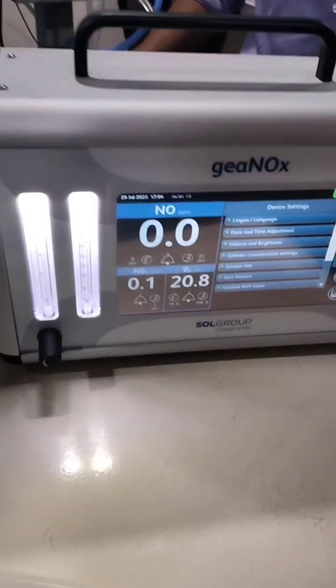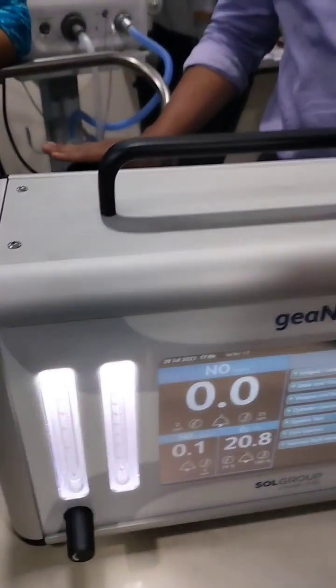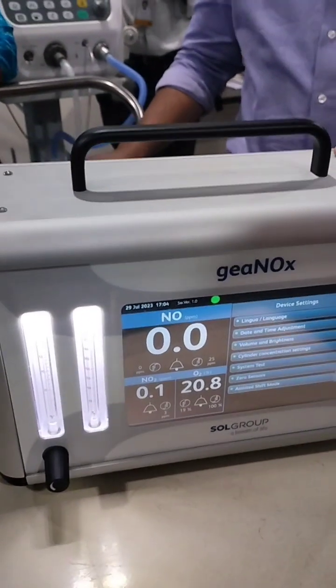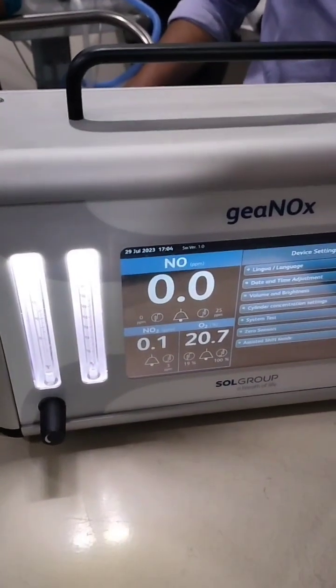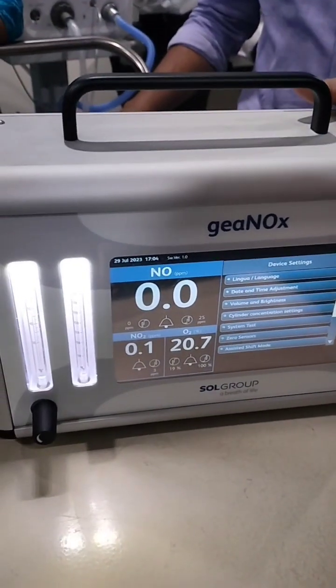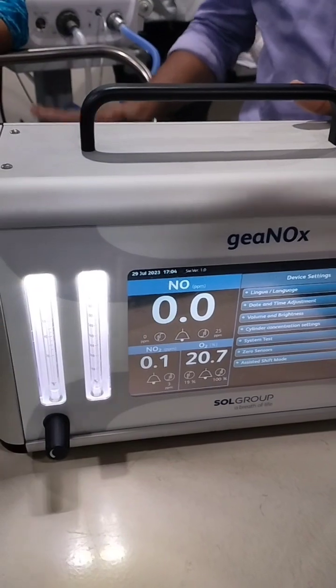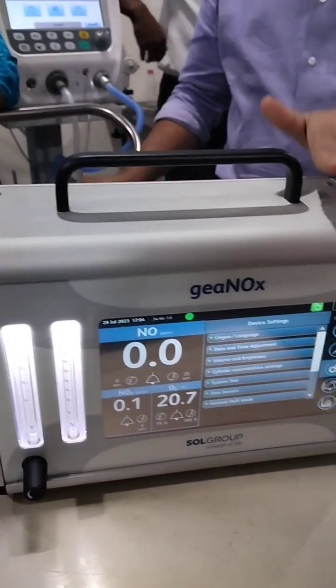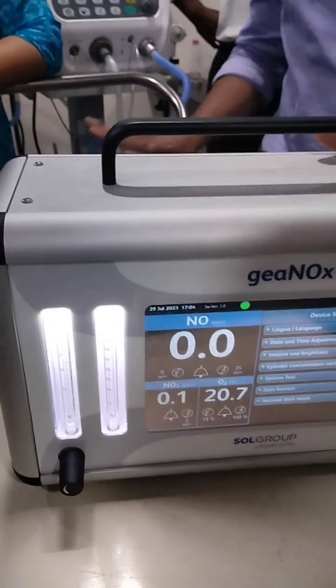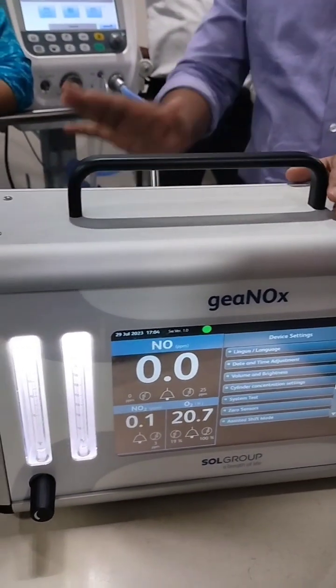Most iNO cylinders come with 1000 ppm, 10-litre capacity, at a pressure of more than 100 bar. If the pressure drops low, it will give an alert, and based on the remaining pressure it will calculate how much time is left in the cylinder — that is the extra safety feature. Always ensure backup cylinders are in place before starting therapy.